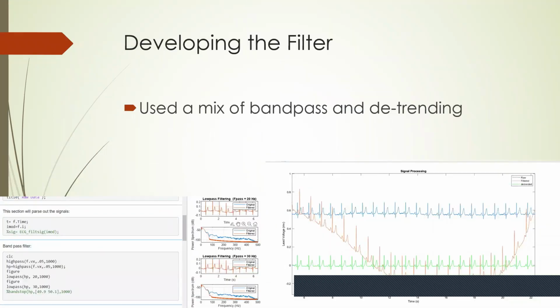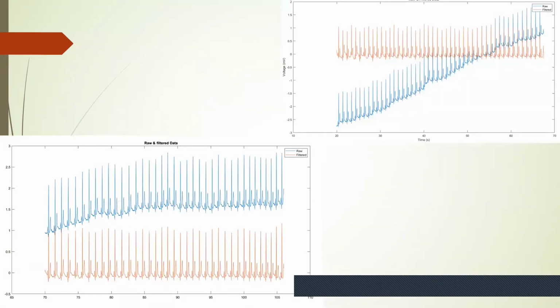This was then processed through a mix of bandpass and detrending algorithms to give a better signal. An example of this can be seen here.